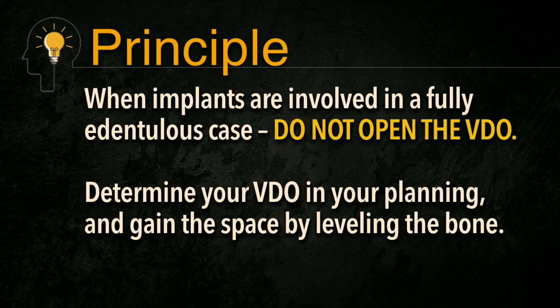So when implants are involved in fully edentulous cases, do not open the vertical. Determine your VDO in your planning and gain space by leveling or tabling bone.